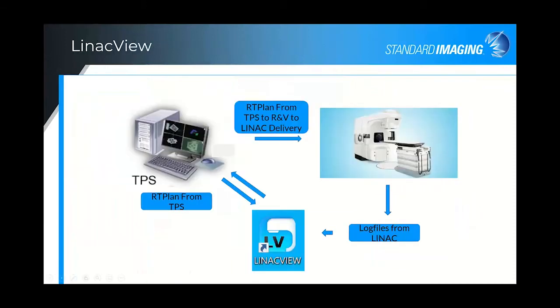So what other solutions should we consider? The next one is LinacView, and this is a log file-based system that extends your plan-specific QA through the LINAC delivery. The workflow is as follows. The RT plan is again exported from your treatment planning system directly to LinacView, and at the same time is exported through the R&V system through to LINAC delivery.